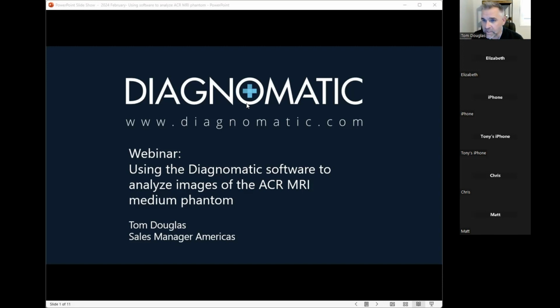So thank you for taking a little time out of your day for our first webinar of the year here. My name is Tom Douglas. I'm the sales manager for North and South America at Diagnomatic. And the topic that we're going to be talking about today is using the Diagnomatic software to help you analyze images of the medium-sized ACR phantom.